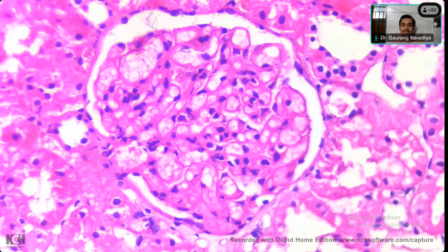In this glomerulus, you can see some thickening. Do you think that there is thickening of this capillary wall? Yes, sir. So you have to look at these capillary walls like this to see whether there is any thickening. Sometimes it's a bit tricky. Early mild thickening is very difficult to pick up. But in this case, I think that there is definitely thickening, and it's looking somewhat rigid. It's not showing any kind of folding, almost standing rigid like this.